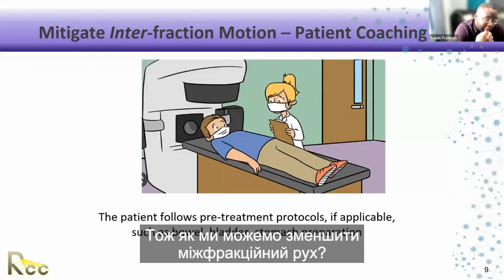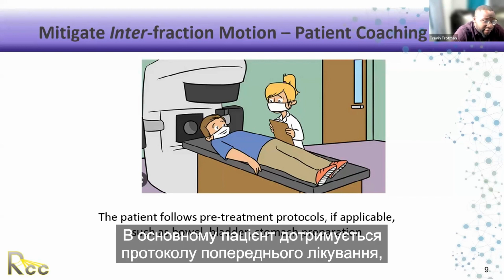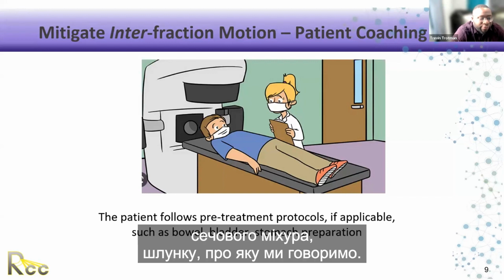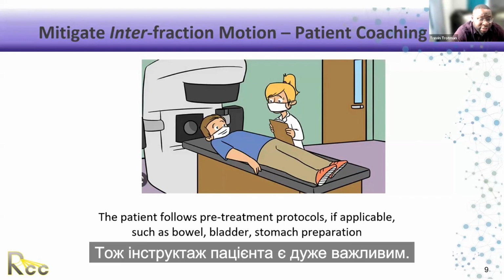So how do we mitigate the interfraction motion? Patient coaching, very important. We see this during simulation. We see this during treatment. We need to coach the patient. So basically the patient follows a pre-treatment protocol, such as bowel, bladder, stomach preparations that we talk about. Is it the enema, is it drinking water, or is it some sort of empty stomach protocol that we need to do? So patient coaching is very important.